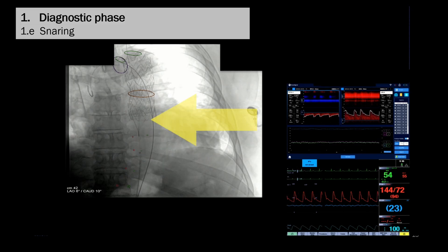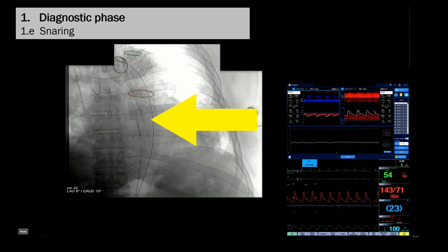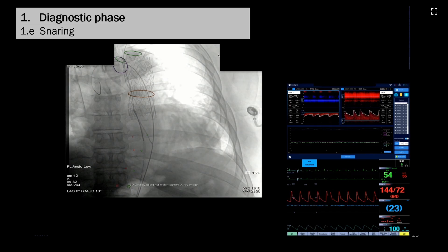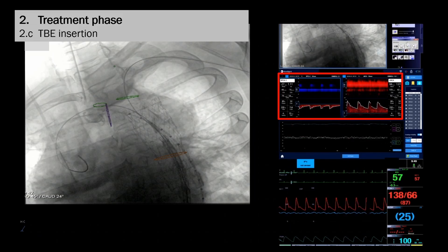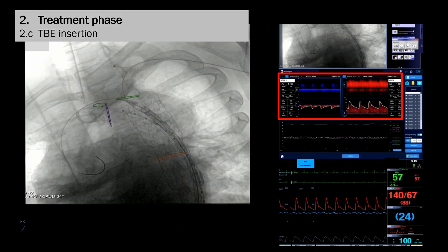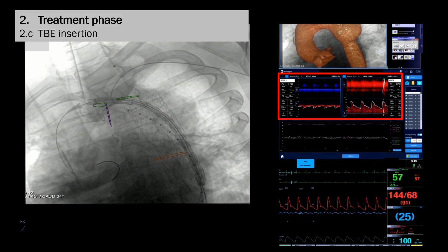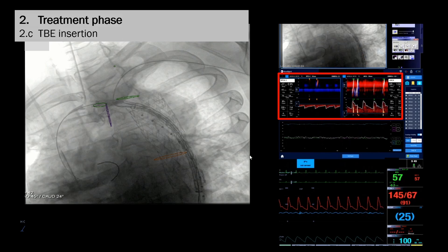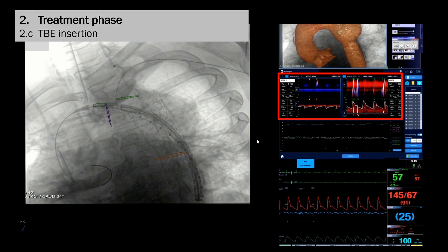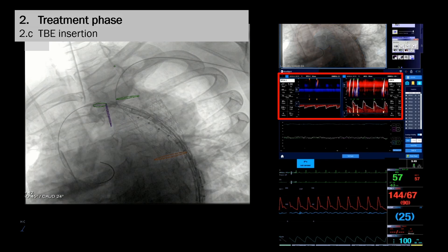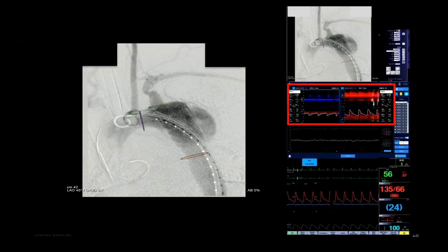From the right groin access, an ensnare device was delivered to snare the wire from the left radial access down through the right femoral access. The second device was the thoracic branch endoprosthesis measuring 31 by 15 mm with an 8 mm portal. Correct positioning of this device is extremely important. The device is advanced over the preloaded wire from the left radial access to guide and position the portal at the left subclavian artery orifice. Some hits are seen bilaterally on the TCD screen from positioning the thoracic branch endoprosthesis. The pre-deployment angiogram before deploying the TBE shows proper alignment of the portal with the left subclavian artery orifice.